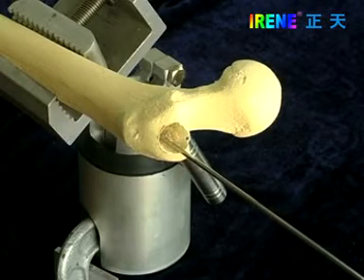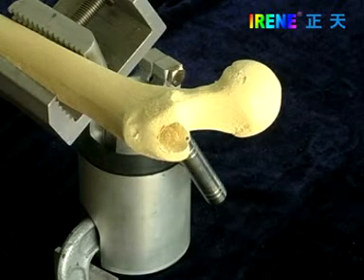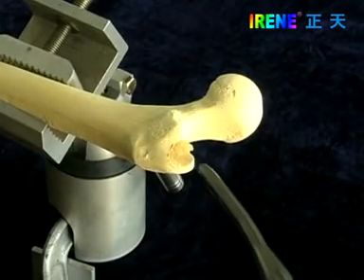Take out the threaded guide pin and insert the nail.